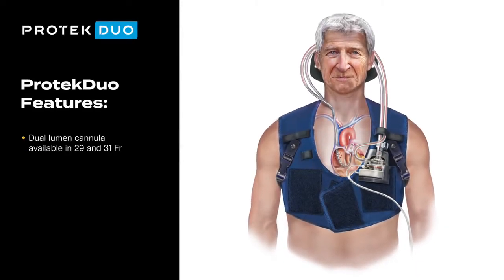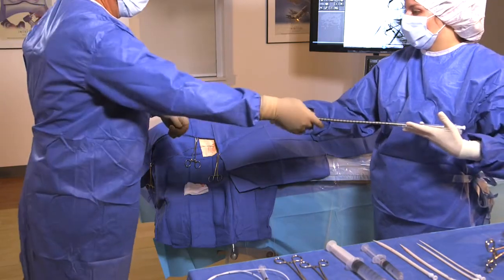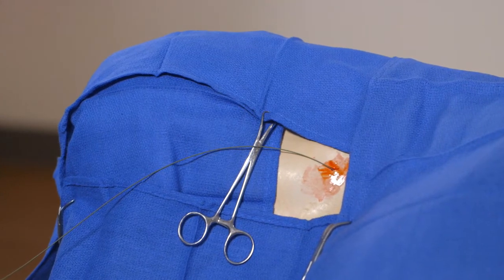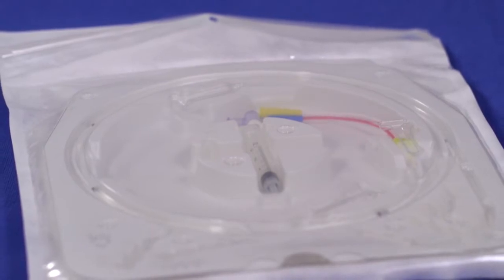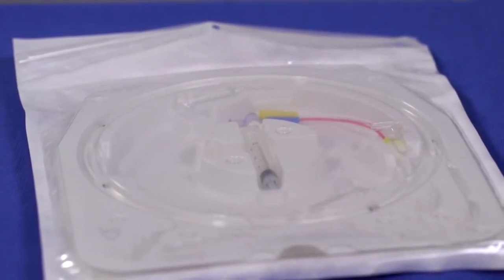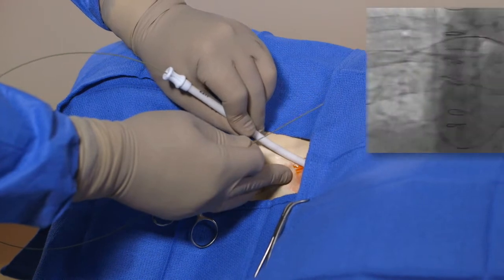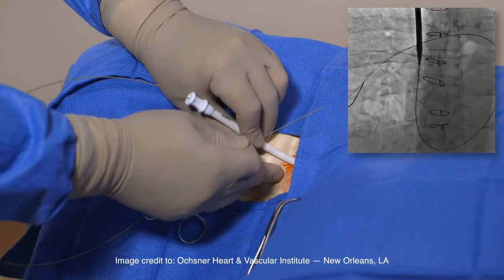To place the PROTEC DUO cannula, the right internal jugular vein is the preferred insertion site. Introduce the guide wire through the needle and advance to the desired position. A flow-directed pressure catheter may be used to aid in proper cannula tip placement. Serial dilate the entry site to 26 French and administer heparin to raise the ACT level over 400 seconds.